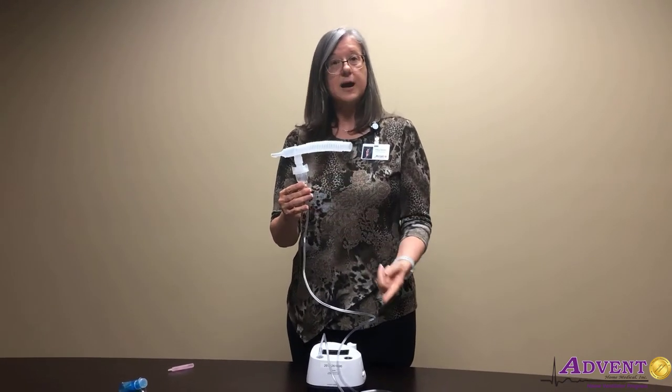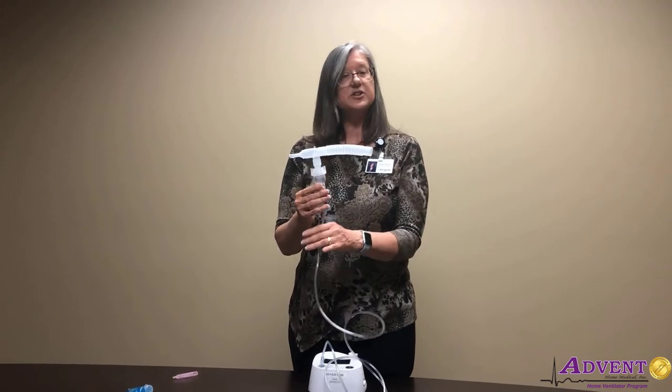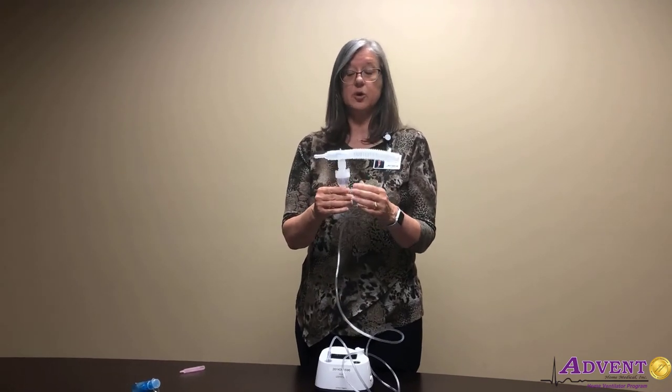If you're having problems with your nebulizer treatment — say it's taking too long — check your nebulizer tubing and see if there's a kink in there; you might need to get some new tubing. The other thing is maybe it's been tilted for a while.